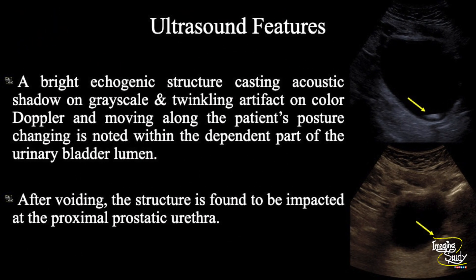In summary, a bright echogenic structure casting acoustic shadow on grayscale and twinkling artifact on color Doppler, and moving with changes in patient posture, is noted within the dependent part of the urinary bladder lumen. After voiding, the structure is found to be impacted at the proximal prostatic urethra. These features conclude this as a case of vesical calculus which got impacted at the prostatic urethra during voiding.